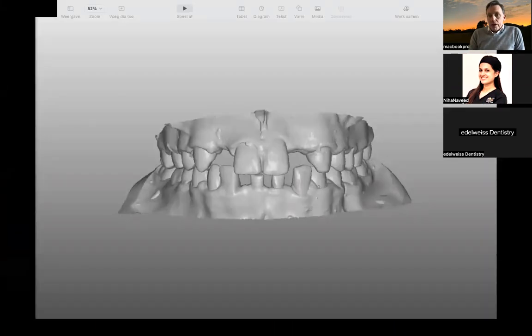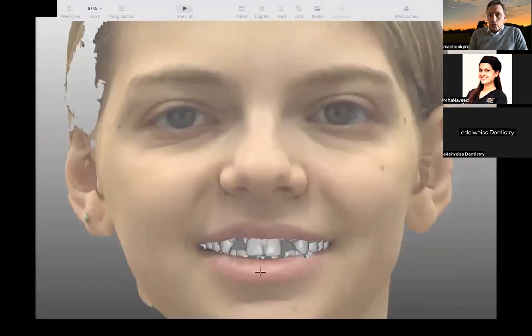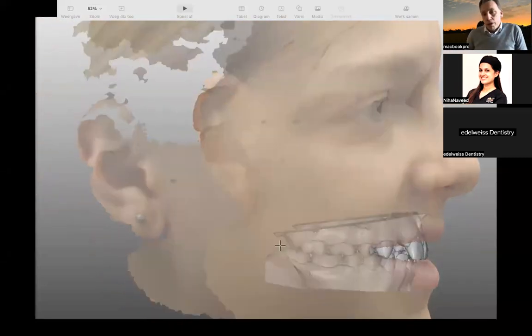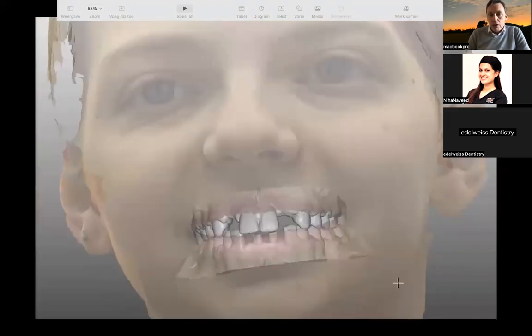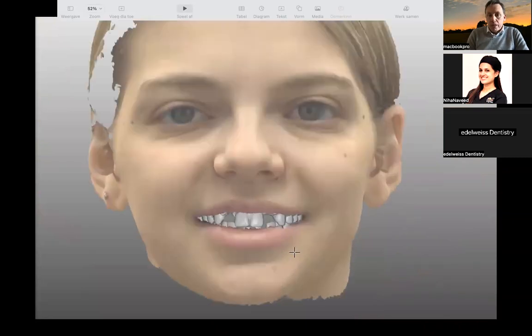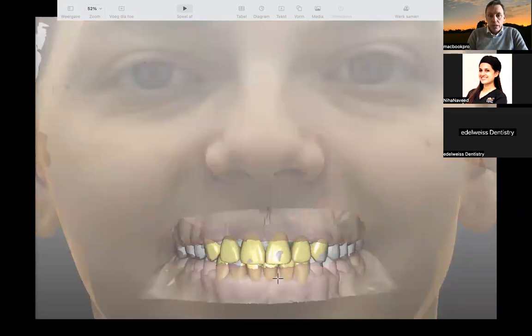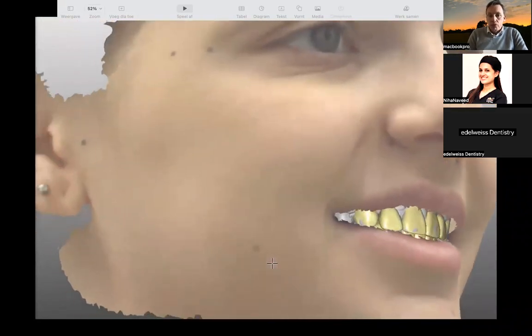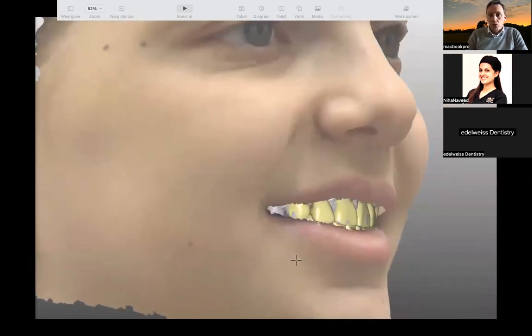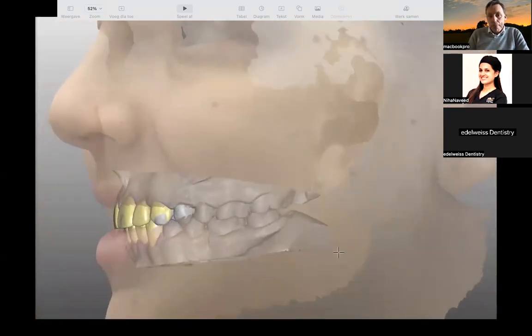This finally is going out, like you will see here in more detail. We put everything into the mouth of the patient, and that's important for getting the aesthetics. We do the face scan on top. We check occlusion. We check the aesthetics. We place teeth into the mouth of the patient. You will see immediately, we check once again aesthetics, smile line, form, everything we need. And once we agree that we are sure we want to go this way, we go into the surgical procedure.